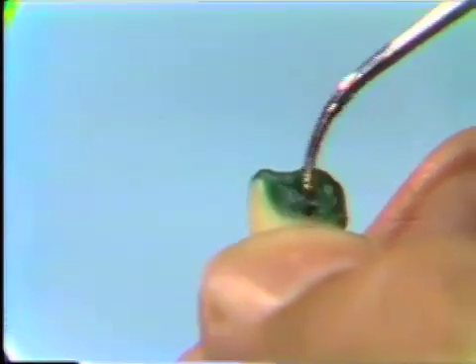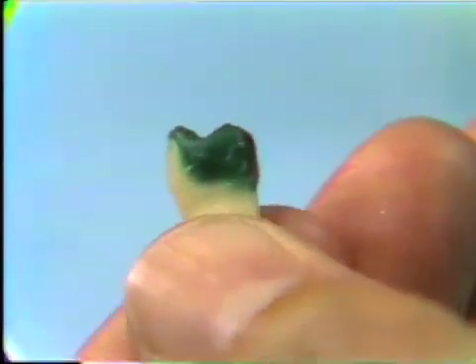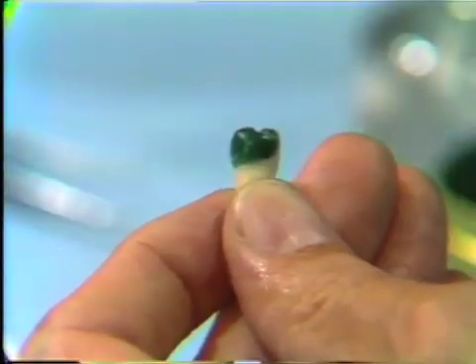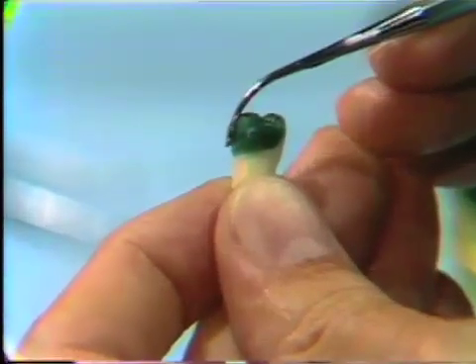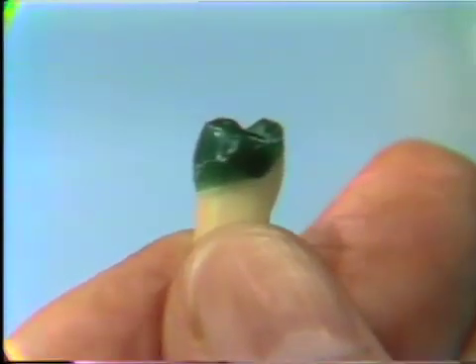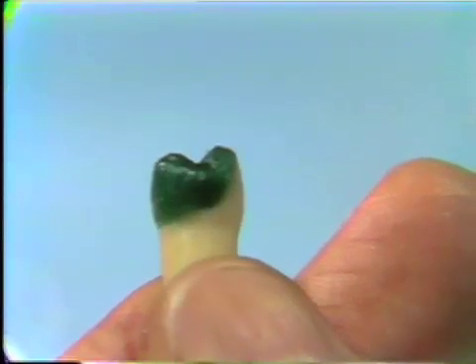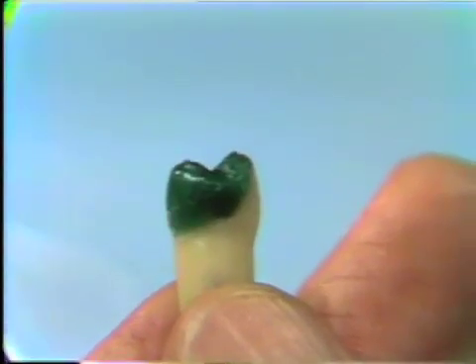That allows space for the interproximal interdental papillae. The wax currently has just a rough contour; it isn't finished and we will polish it when done. By using the instrument warm, you can iron the wax and achieve a certain amount of smoothness. We're going to fade out briefly, put the tooth back into the typodont, develop some of the occlusal anatomy, and then show the end part and the final wax.